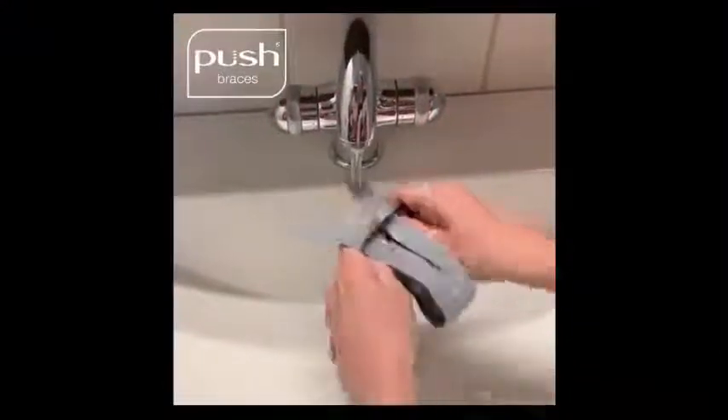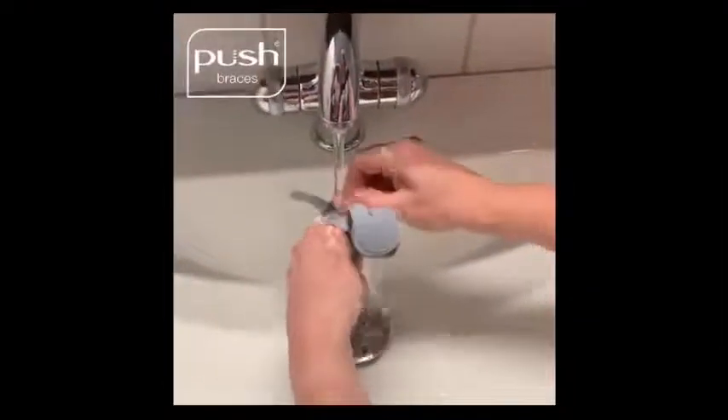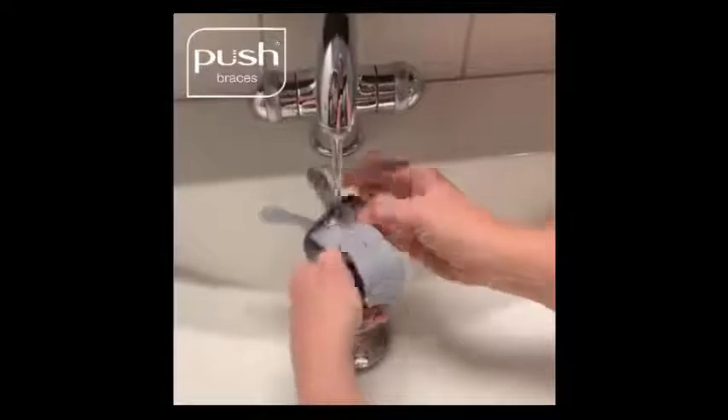The Metagrip is easy to keep clean. Wash your Metagrip when you wash your hands using hot soapy water and towel dry.